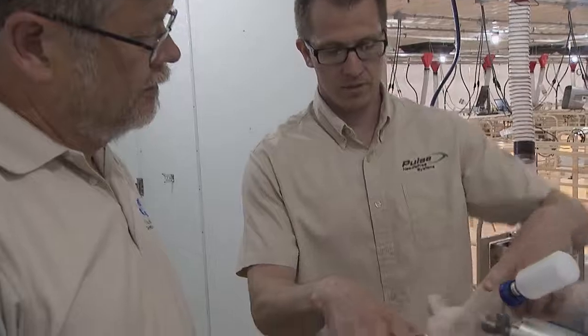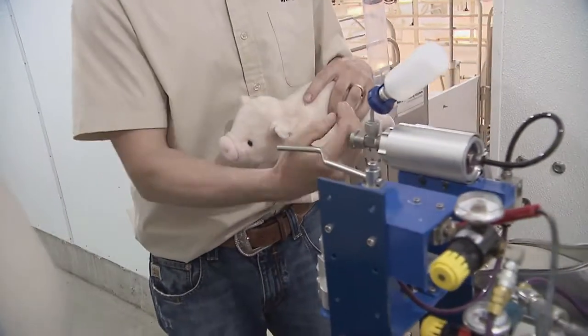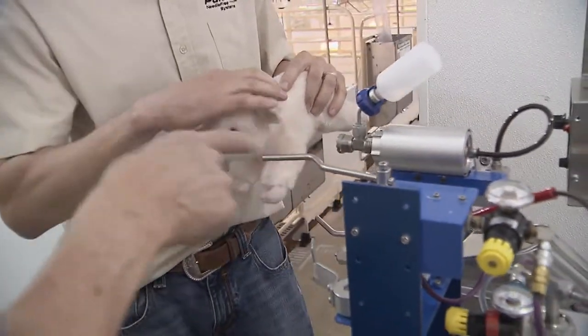It will not inject until you slide the safety over. Once you slide the safety over, then we'll let you apply enough pressure to the tip. Let's see that action.